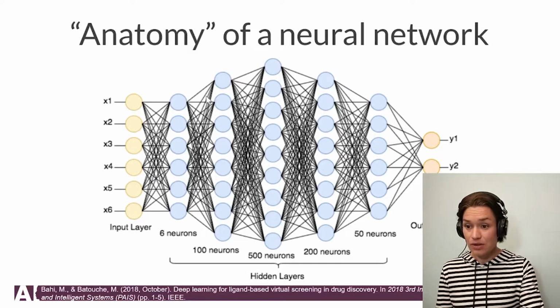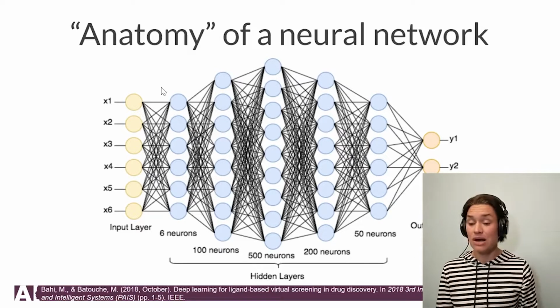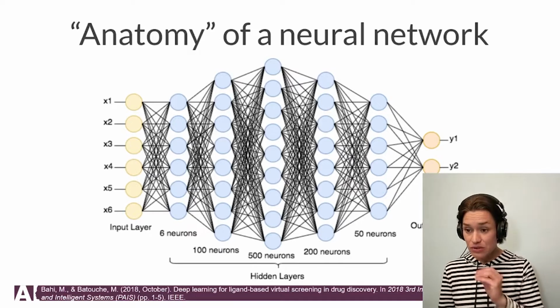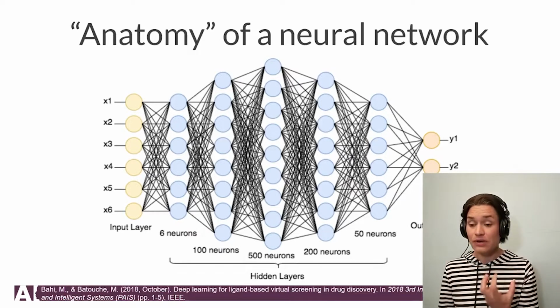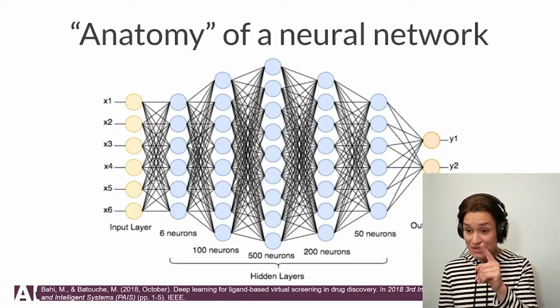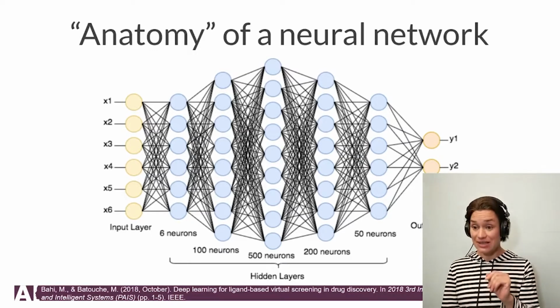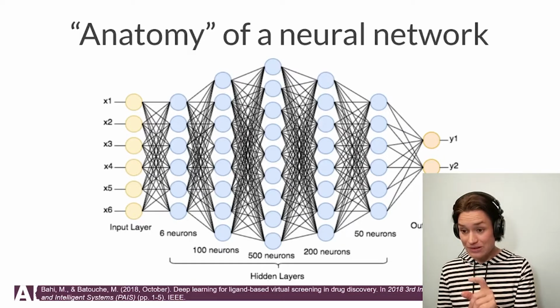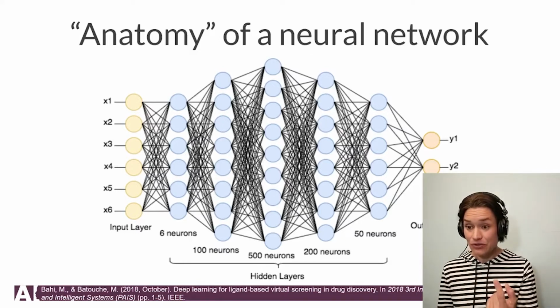And there are those lines between the neurons. These connections are weights. And weights are the strengths of the connections between the neurons. And those neurons look for features, so look for characteristics of an image, the ones that a person is not putting in anymore. They are looking for this, adjusting the strengths of those connections, adjusting the weights. And if the connection between one neuron and the other one is strong enough, the other neuron gets activated.